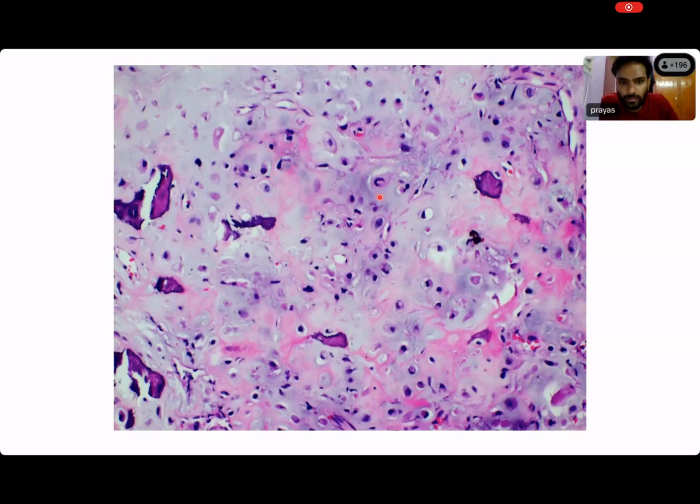Elongated, I'm going to call this elongated. Eccentric has got nothing to do with the shape of the nucleus. What is eccentric? Who said eccentric? Crescent. No, who said it? Who said it? Crescent shape. Crescent, okay, yes. So there is a nucleus which is crescentic over here. What about this nucleus? This is also looking crescentic. There are other nuclei which are irregular in shape. See, there's another crescentic nucleus.